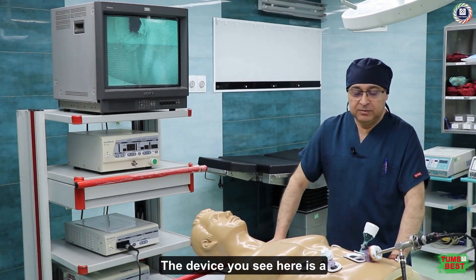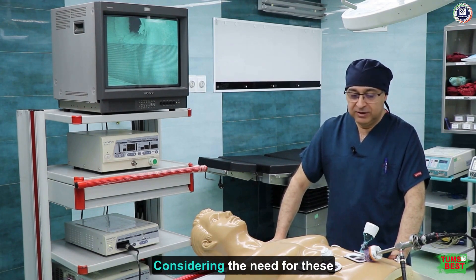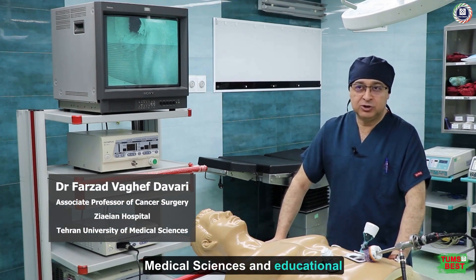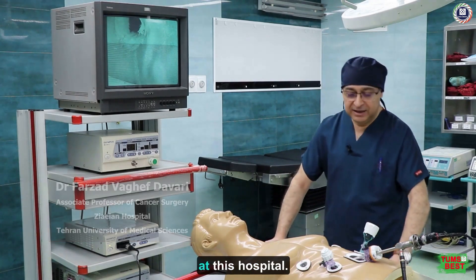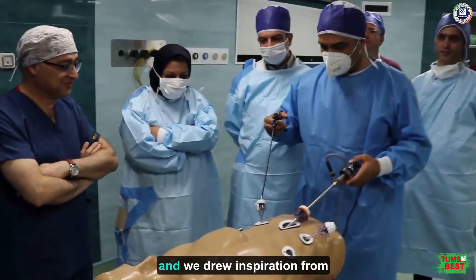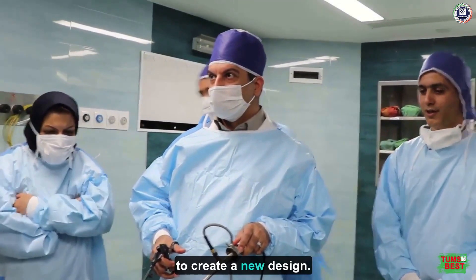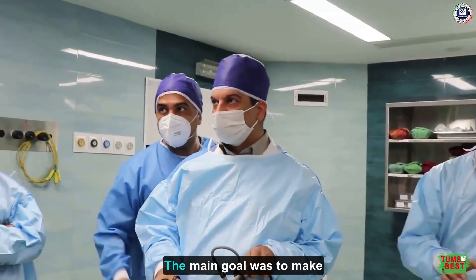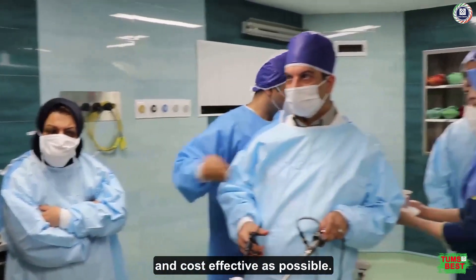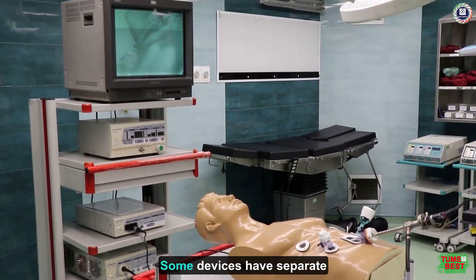The device you see here is a laparoscopic training device. Considering the need for these devices at Tehran University of Medical Sciences and educational hospitals, this device was designed at this hospital. It has a foreign model, and we drew inspiration from both domestic and foreign examples to create a new design. The main goal was to make this device as simple and cost-effective as possible.